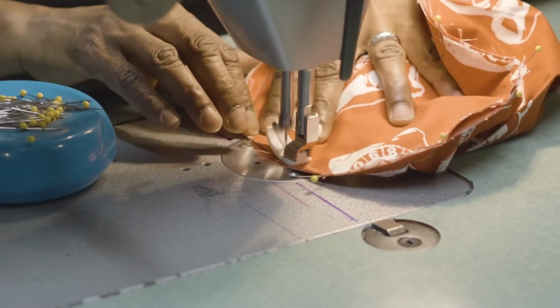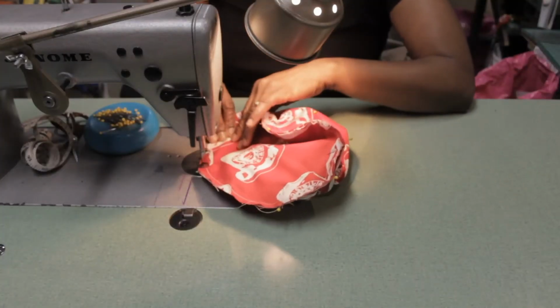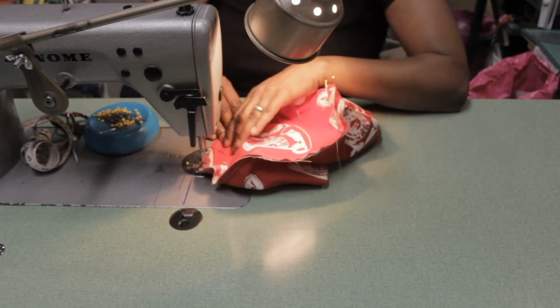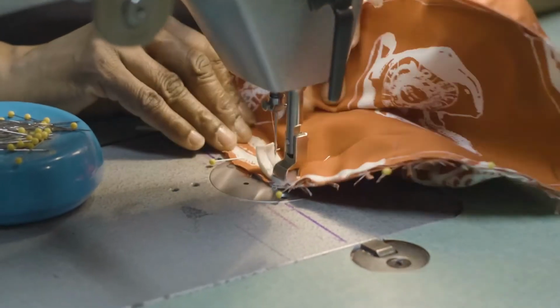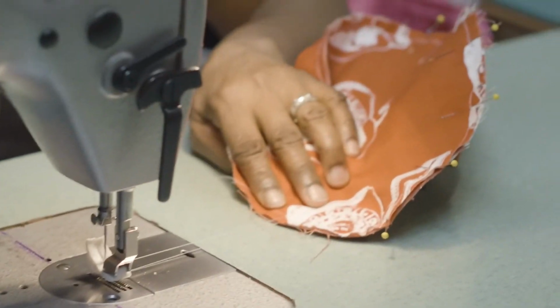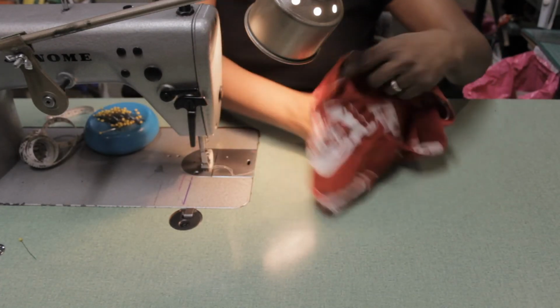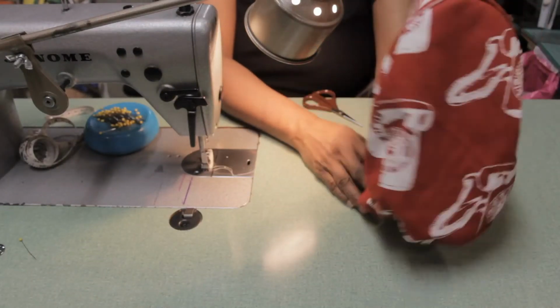And I am back to the front, and I like to do 2 rows of seams just to make sure that it's secure. And as you're going along, try to make sure that you're not sewing any other part of the cap. You're not catching any of the cap in your stitching here. Once you are done your 2 rounds, you don't even have to backstitch. You cut it, and I'll pull my pins out, and you have a scrub cap. Turn it right side out, and that's it. When you bring it, I will serge the inside, and there's your scrub cap.